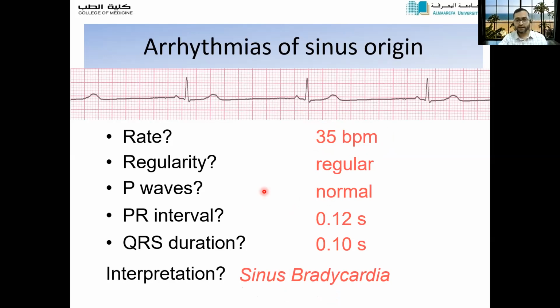And sinus bradycardia can be present in non-pathological conditions, it is not always pathological. So as I said before, all arrhythmias are not pathological or abnormal.